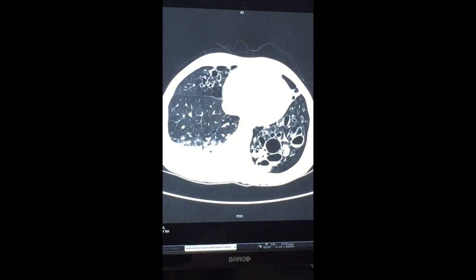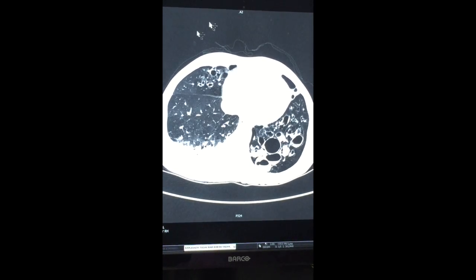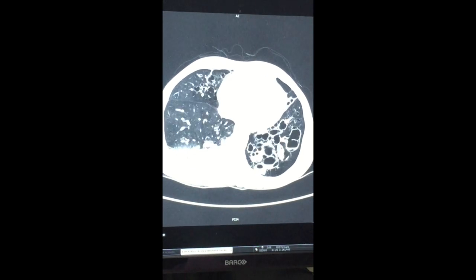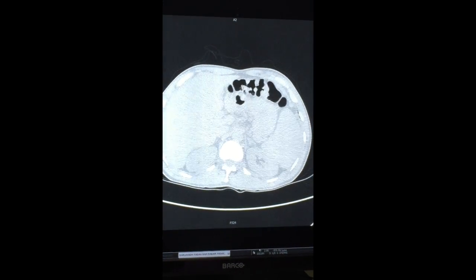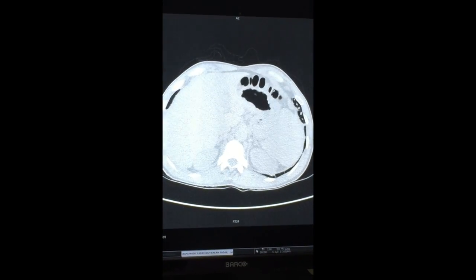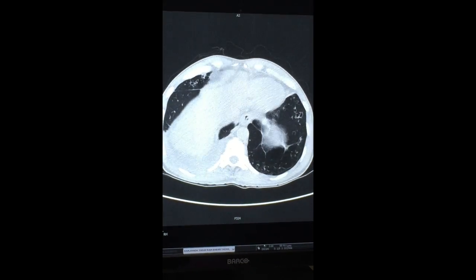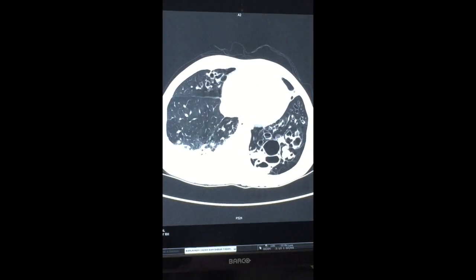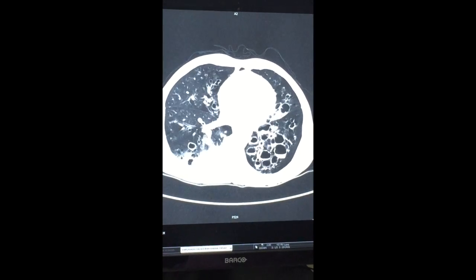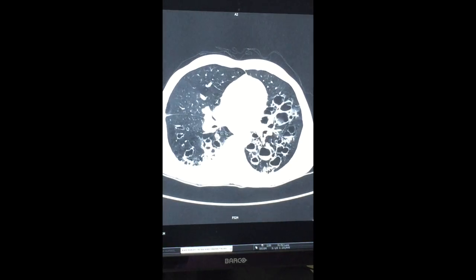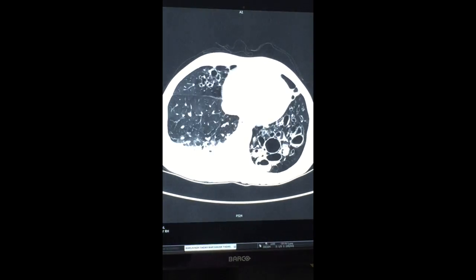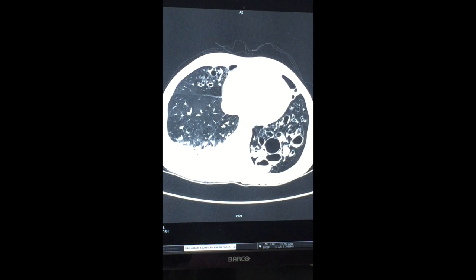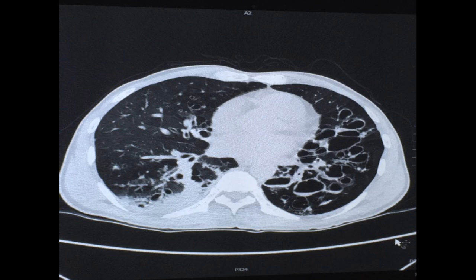The most common pathogen is Pseudomonas aeruginosa, followed by Staphylococcus aureus, Haemophilus influenzae, and non-tuberculous mycobacteria. In the radiological findings, bilateral diffuse abnormal cystic dilatation of bronchioles was found, mainly in the left lung.